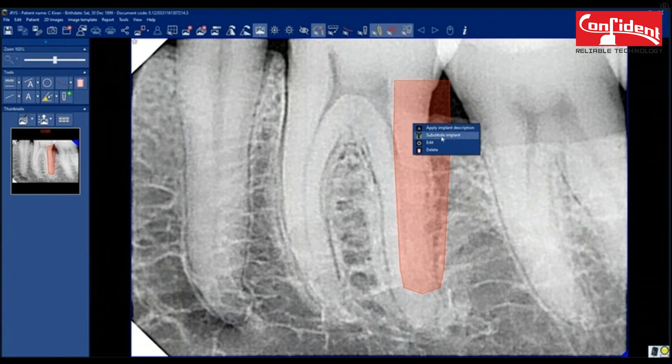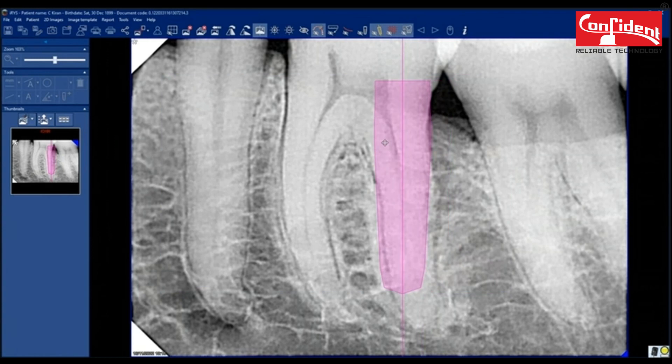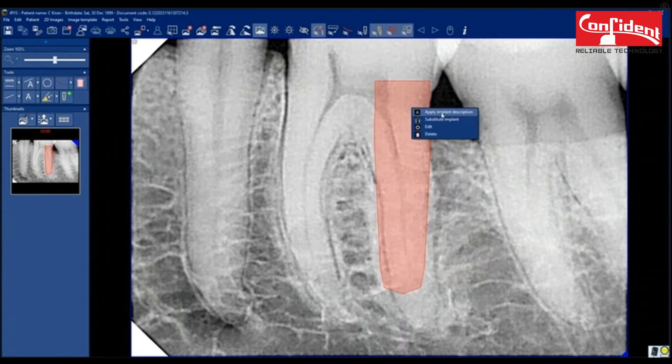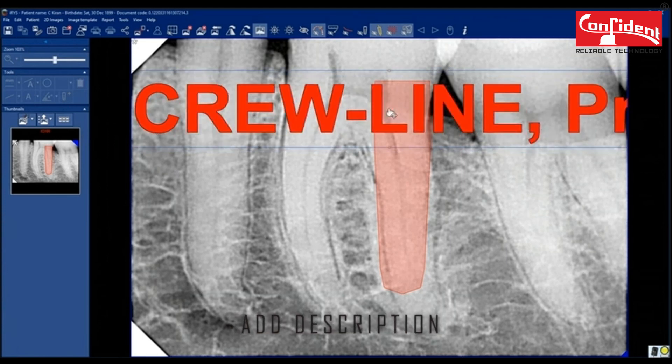You can edit the implant using edit option. Hide or show implant. Add description.